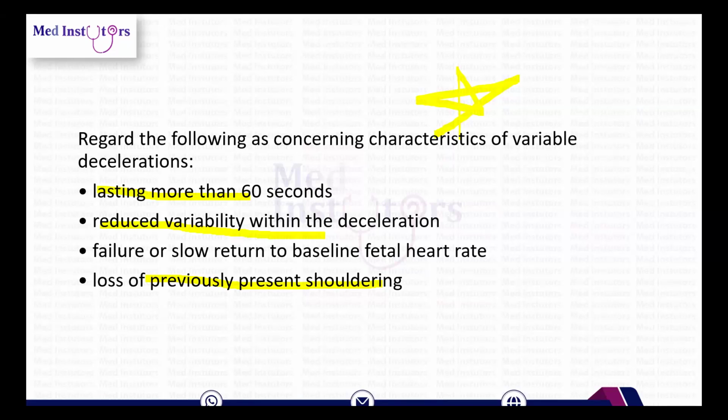By our course, and while we are doing these questions, I'll also ask the team to come up with a document which has all the CTGs possible so that you all can look at them as pictures. Okay, because it's important to be able to decipher these CTGs. And another thing is that you have to try to remember the small nuances in the variability, the minutes, all of these are what is an amber feature, what is a red feature, and then how do we categorize it as normal, suspicious, and pathological.